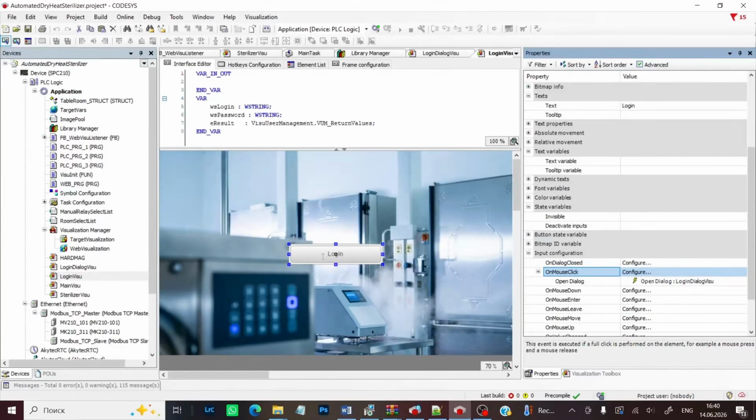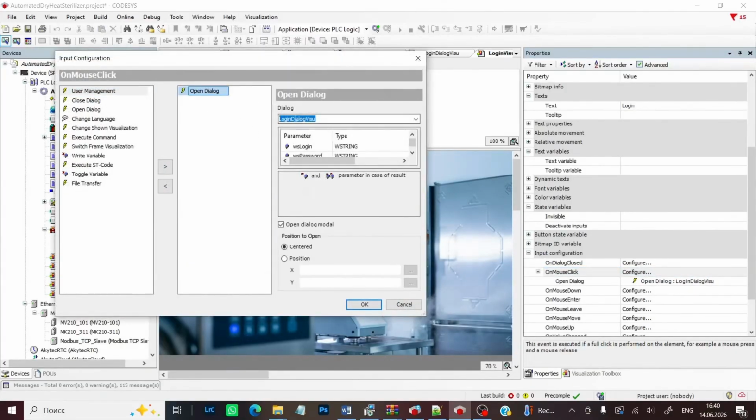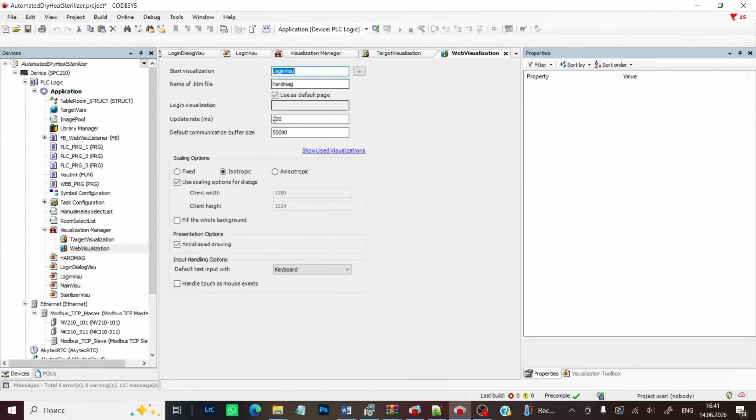Here I added a single login button, and for the click event handler, I chose the Open Dialog function, where for the dialog field, I selected the visualization of our dialog window. As the start page, I specified this visualization file in the device tree for the target and web visualization components.